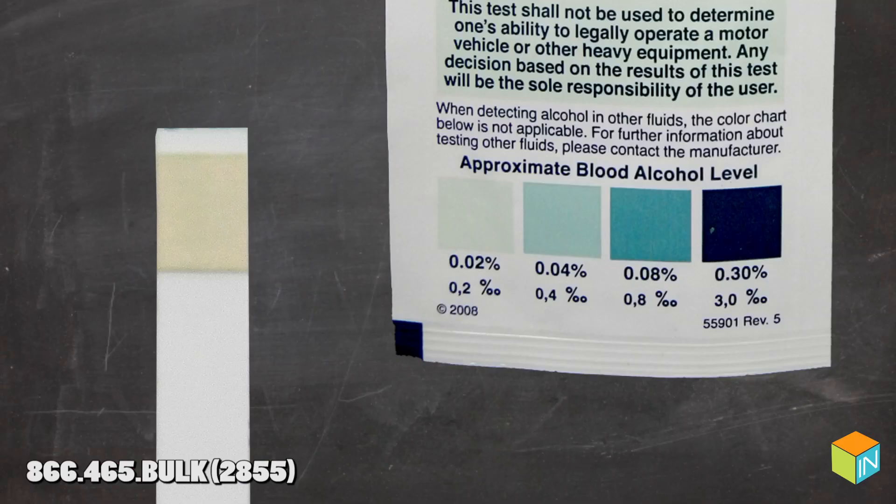Step 2: At 2 minutes, compare color of test pad to the color chart on the test package. Step 3: Estimate the BAC by reading the number printed below the color block that best matches the color of the test pad.